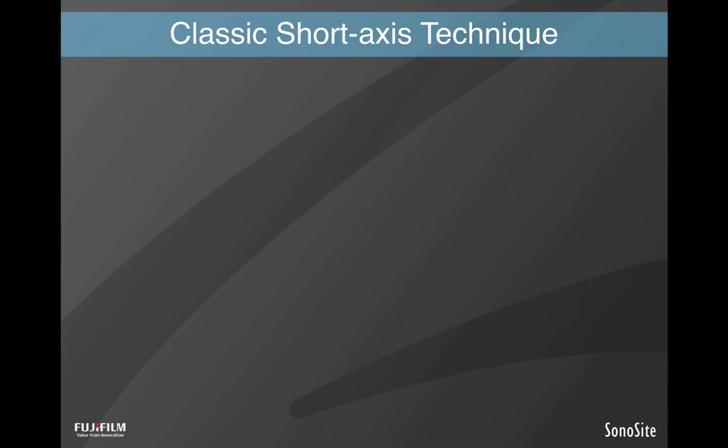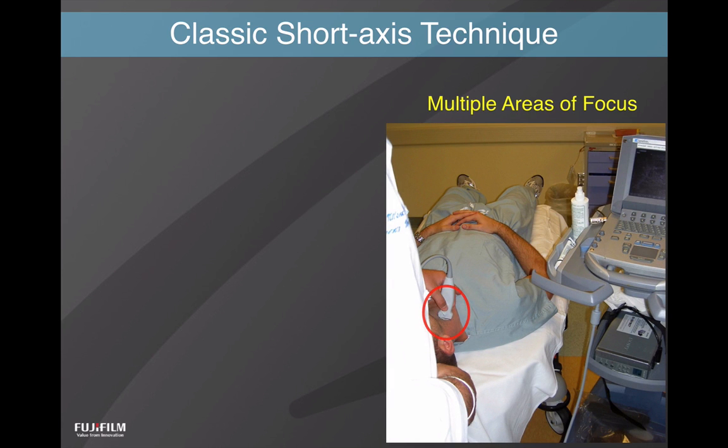So the classic short axis technique, this is how I was taught. The way I was taught was to hold a probe, and then as you look at the screen, advance the needle and visualize the needle tip. The problem with that for me is, as a novice sonographer, somebody who's not done this very often, moving the probe, moving the needle, aspirating, and looking at the screen really can cause a lot of confusion and makes it difficult for the novice provider. And I see residents flail at this.